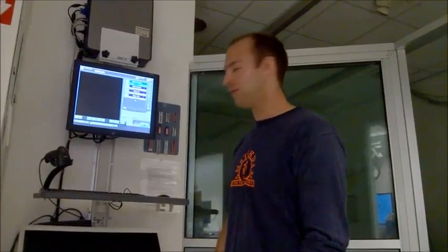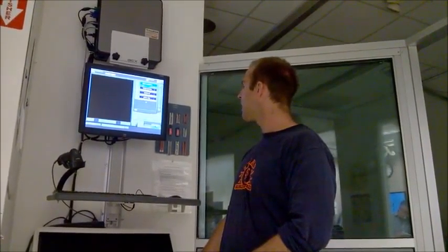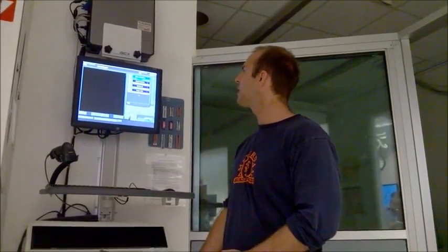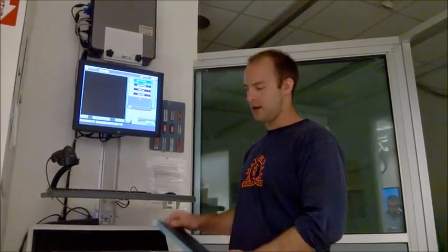Alright. Okay, my name is Ben Scalati. I just got an order in from the doctor to do a sinus series. So what we're doing is a Caldwell, a Waters, a lateral, and an SMV. Now I put in my patient's first name and last name and date of birth, and I cleaned the IR, and I cleaned the vertical grid, so we're all set to go.